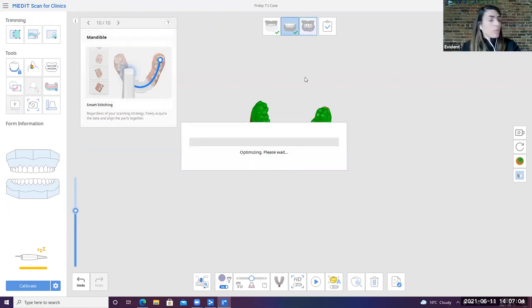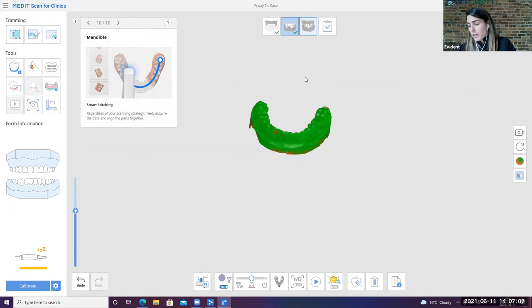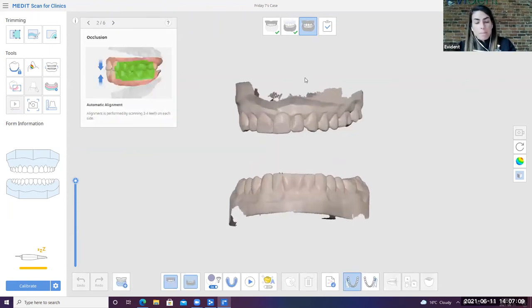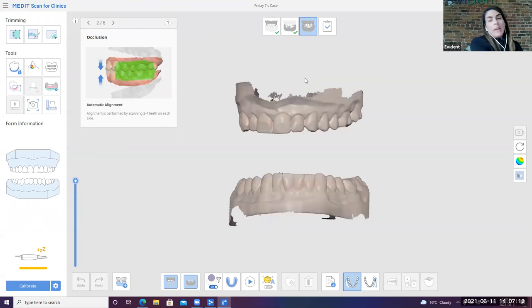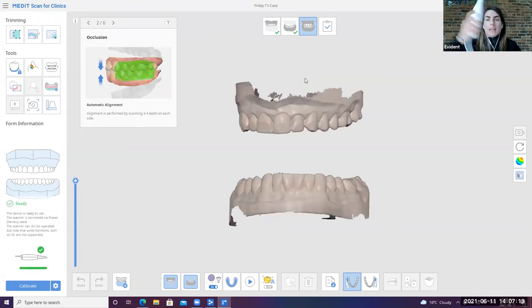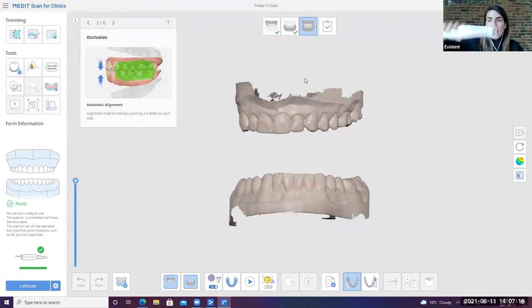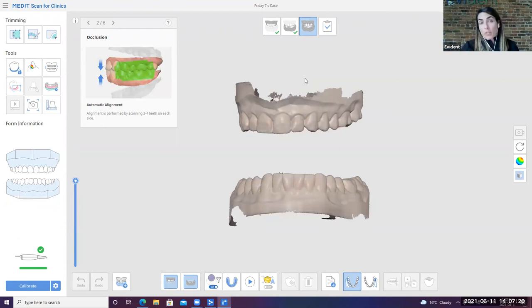So I'm just going to go ahead and try to capture the bite. So I'm going to put my models back onto the articulator. When we go to capture the bite, it is done in a swooping motion like so. And it should only take a couple of swipes for you to be able to register if you've captured all of your markers appropriately. I'm going to go ahead and try scanning this.